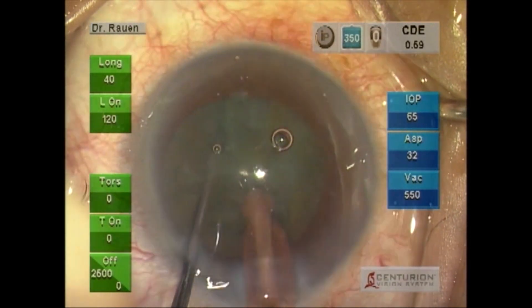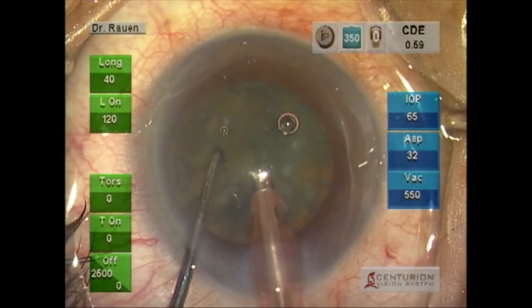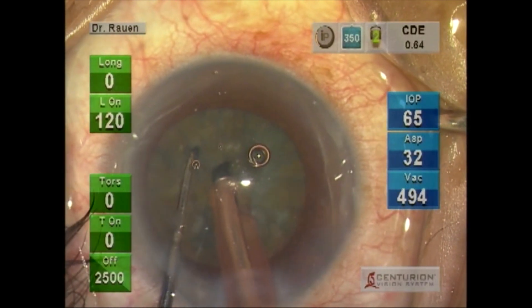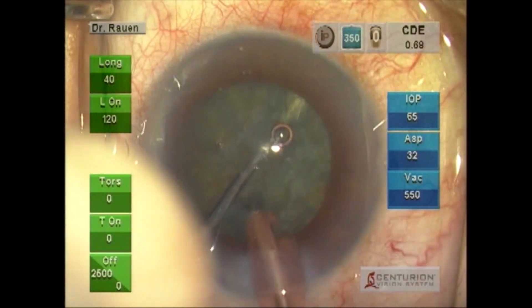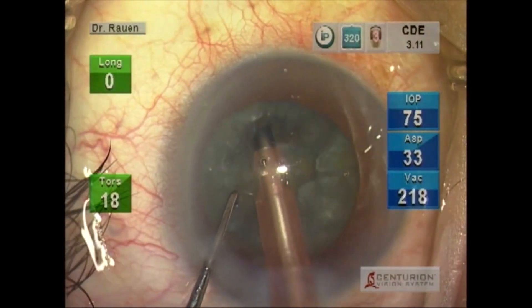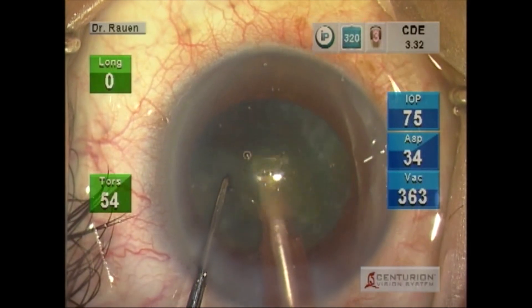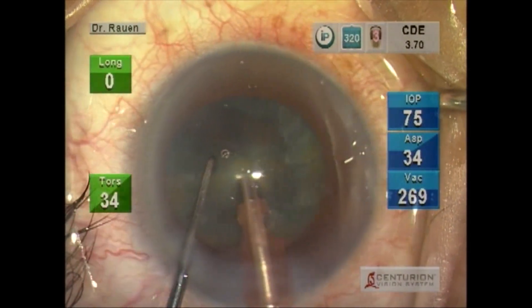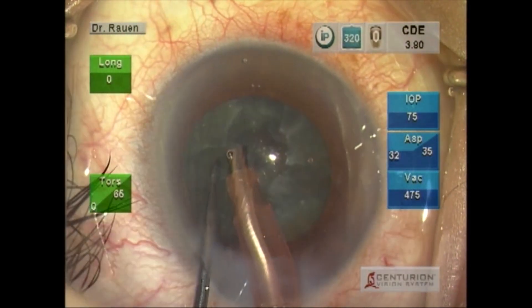Please pay attention to just how stable the chamber is — there is very little movement of the iris, and later in the procedure, very little movement of the capsular bag. One of the beauties of this technology is just how efficiently it removes nuclear material; at times it seems like the nuclear material just disappears.